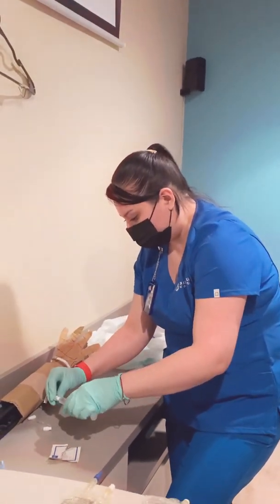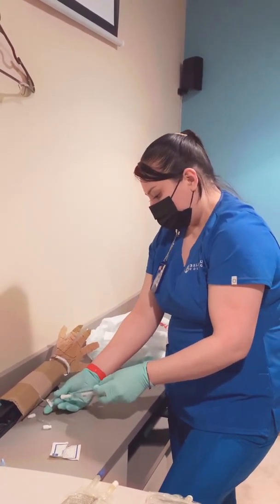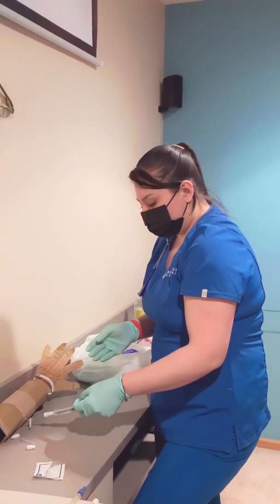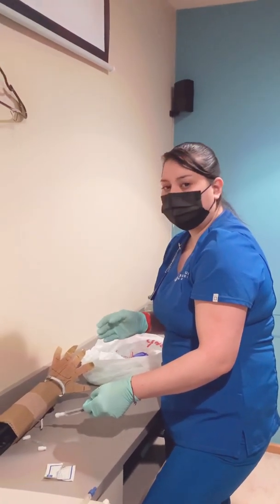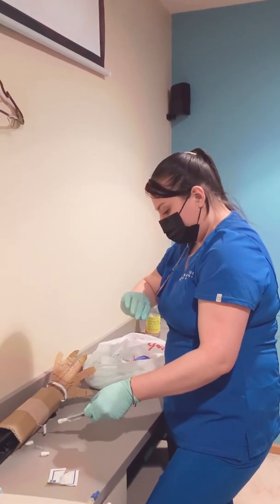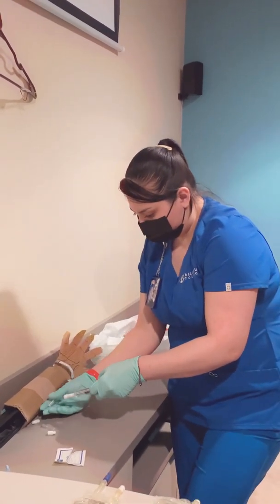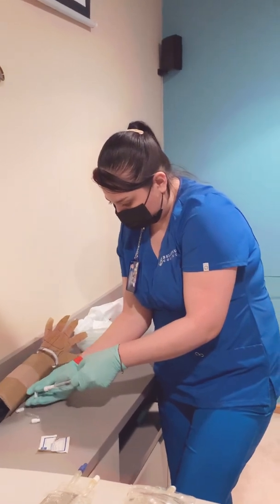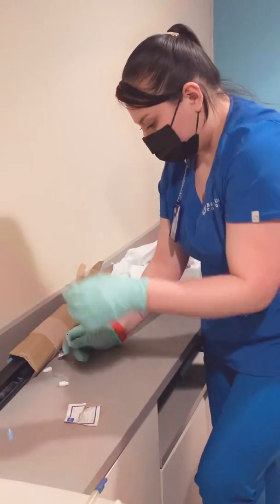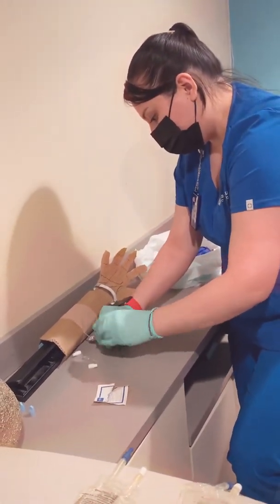Attach it to the hub, unclamp, and I'm going to administer this at the same rate that I did with the ondansetron, and I'm administering 3 to 5 ml. Okay, I'm going to clamp, remove, and then I'm going to grab a cap that will protect and sterilize the hub.